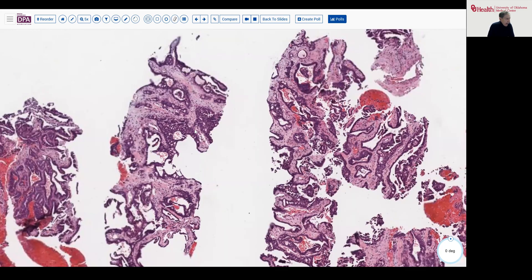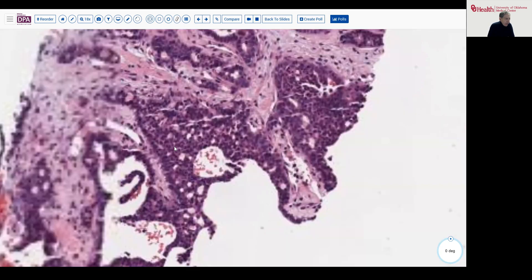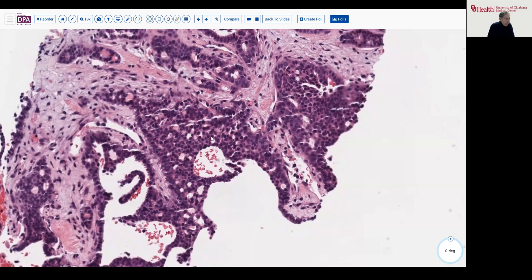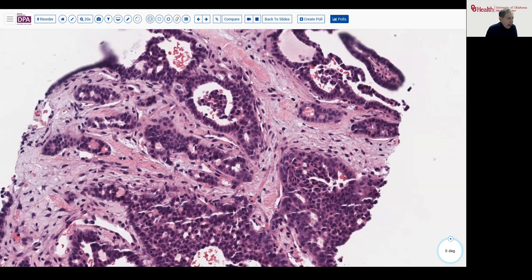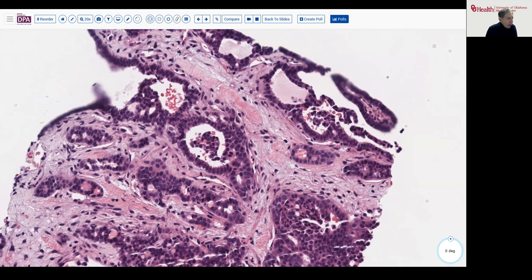You can see the nuclear features — fairly round nuclei. A lot of things in looking at this biopsy suggest the possibility that this could be breast carcinoma metastatic to the liver. There's not much in the way of necrosis, however, and many of the nuclei are relatively lower grade overall speaking.